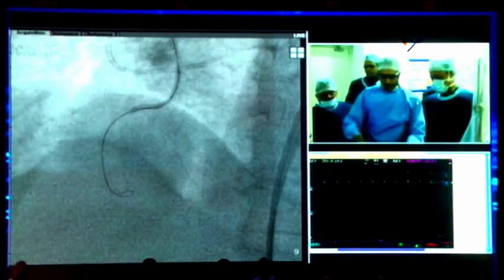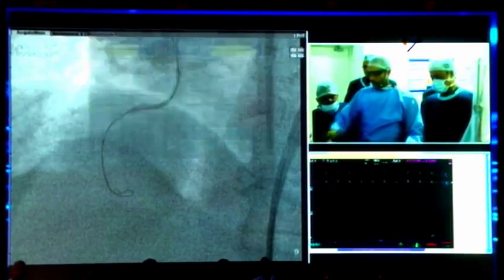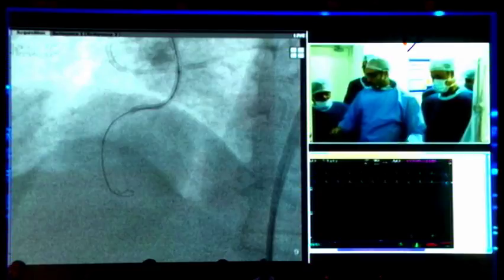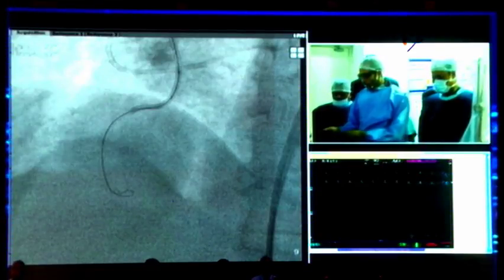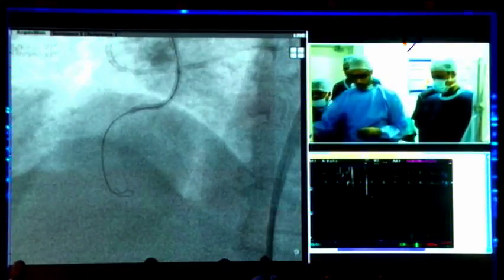We'll see. Is it deliberate knuckling or actually accidental knuckling? No, deliberate. Deliberate means will you use the Gaia Second as a wire for knuckling? No, I switched already to an XTA. Oh, XTA already. Sorry guys, I think I told you that.